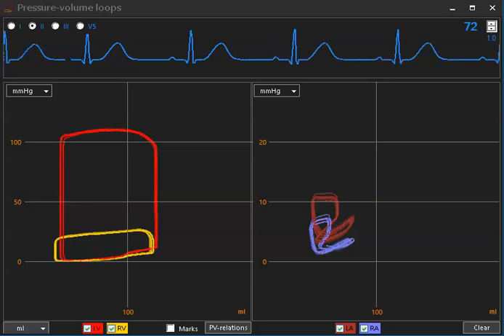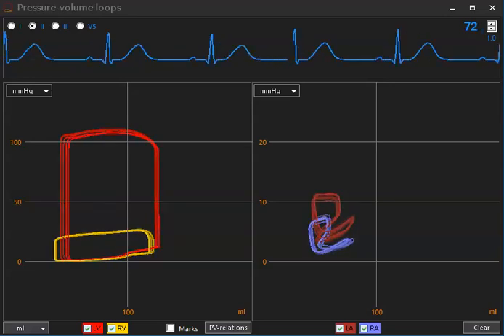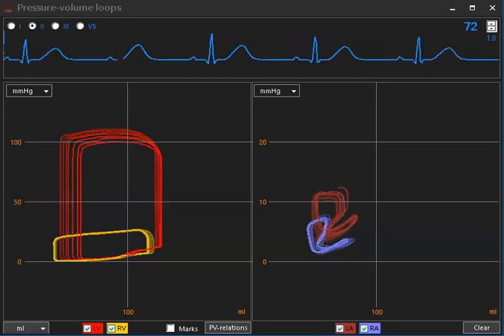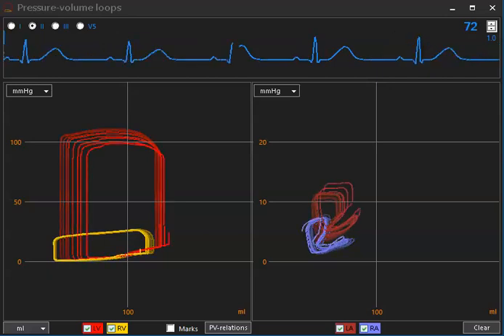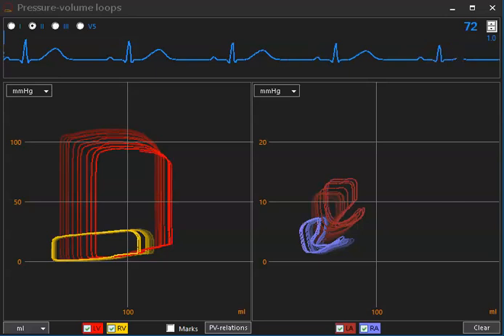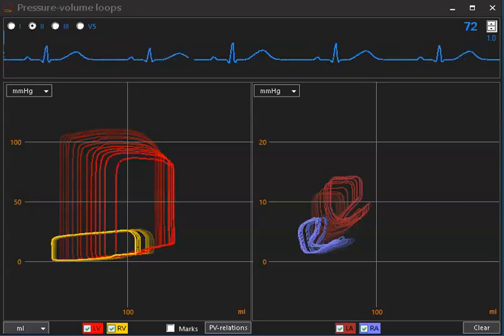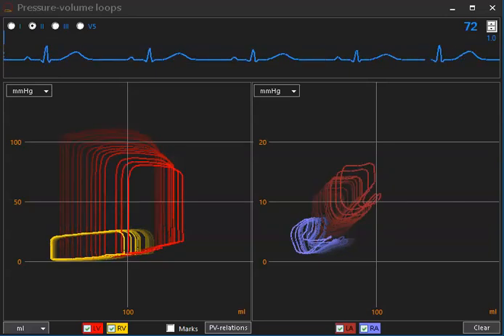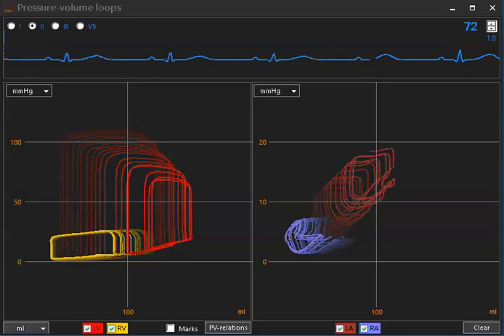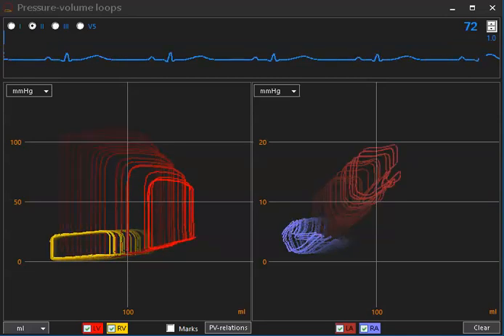So I start by reducing left ventricular contractility, approaching a low cardiac output state with preserved right heart function. You see that left ventricular loops move to the right, meaning dilatation of the left ventricle.